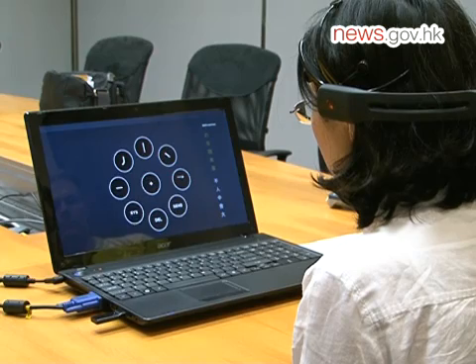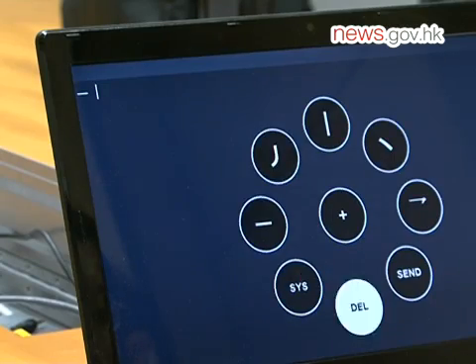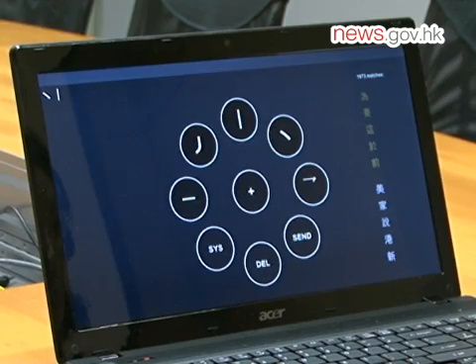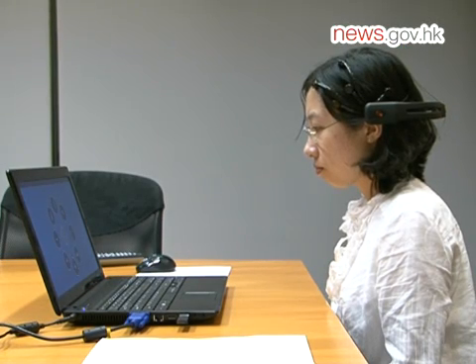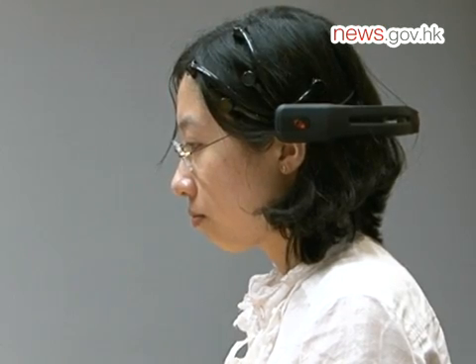It can take from 3 to 5 minutes for the unit to process even a short, simple sentence, from the receipt of brain waves to system identification and translation. The main challenge has been making it easy to use, fast, and accurate. Factors beyond the developer's control can sometimes affect its performance, such as the user's mental and emotional state.